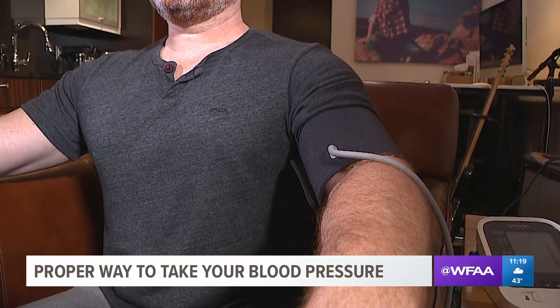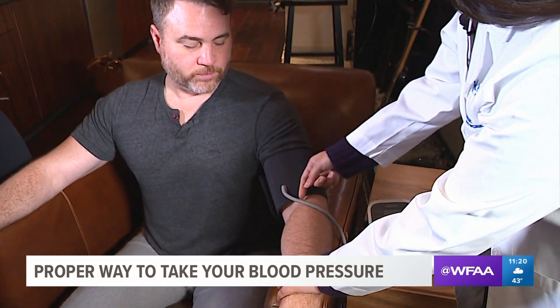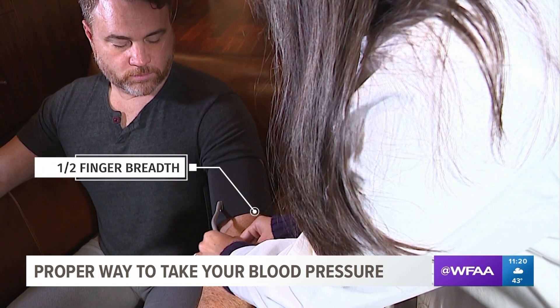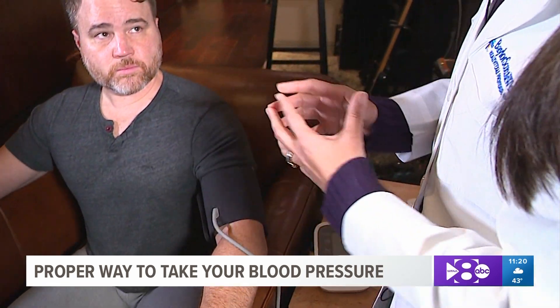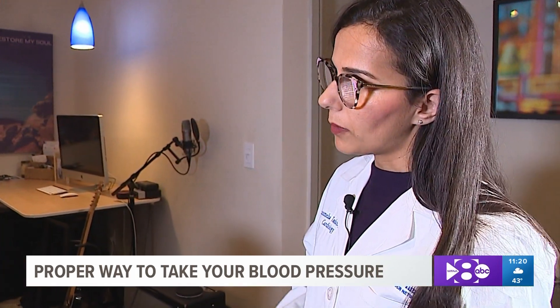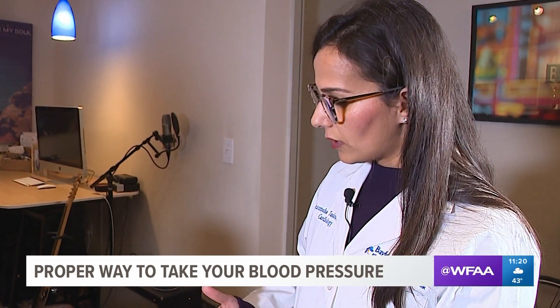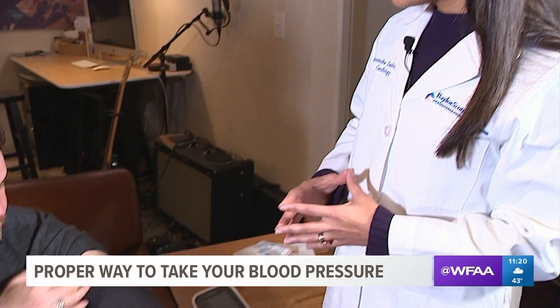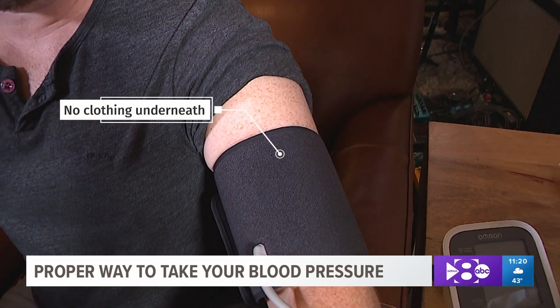The positioning of the cuff is also very important. You want to make sure it is at least one half a finger-breadth above the bend of the elbow. Most machines have a pipe that should be right in the middle of your arm, and some machines have a marker for where the artery sits. You want your arm at the level of your heart, with the elbow at heart level. Also, Jared has the cuff around just his skin — you don't want clothing underneath the cuff.